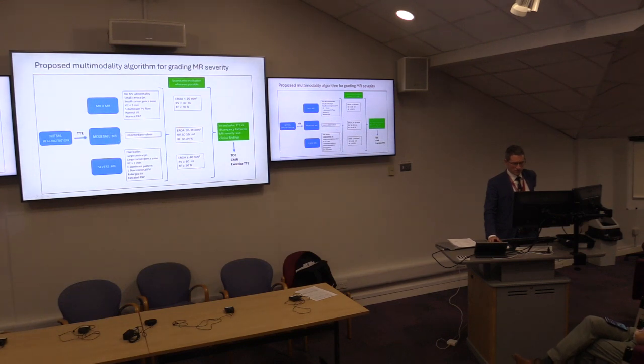But infrequently we're in this area where we don't quite get good enough quality pictures, or we may get some discrepancies in values. And there's a lot of debate about cut-offs around severe versus moderate MR depending on the mechanism, which I'll come to in a bit.